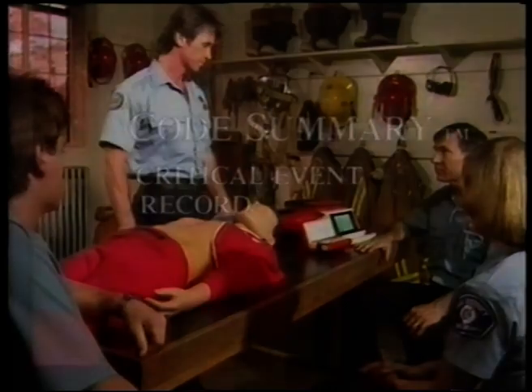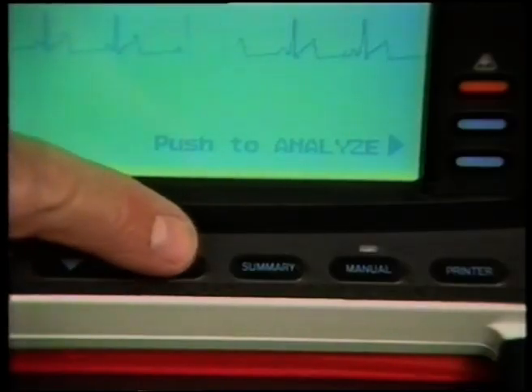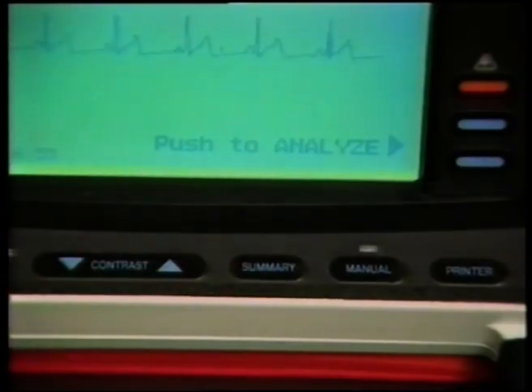The LIFEPAK 300 has a feature called Code Summary. This feature begins storing critical events during a resuscitation attempt automatically from the moment you turn on the LIFEPAK 300 and continues to update information until you turn the device off. To print the summary of critical events, push the Summary button located on the front panel.